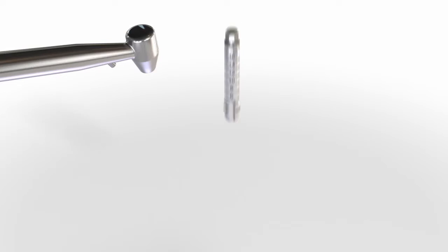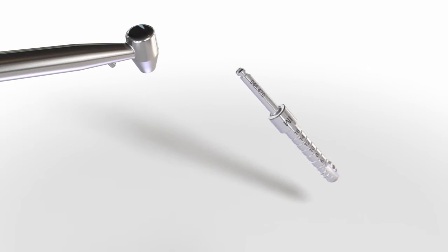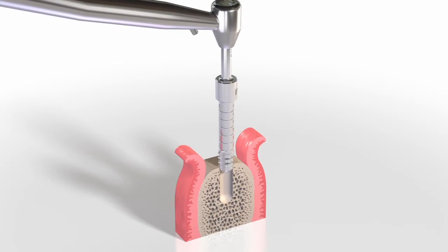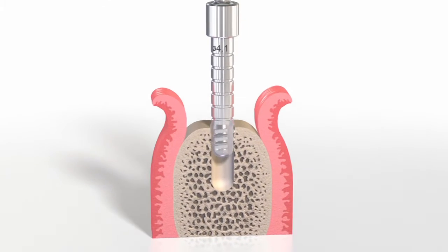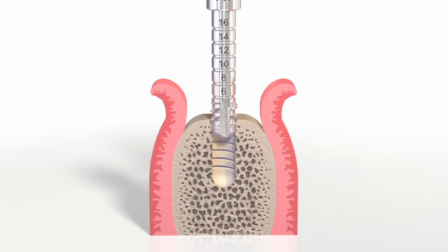For tapping with the handpiece, the tap for adapter is connected to the handpiece through the handpiece adapter. The entire length of the implant bed should be pre-tapped with the standard tap at 15 RPM maximum, and in accordance with the bone class and endosteal diameter.